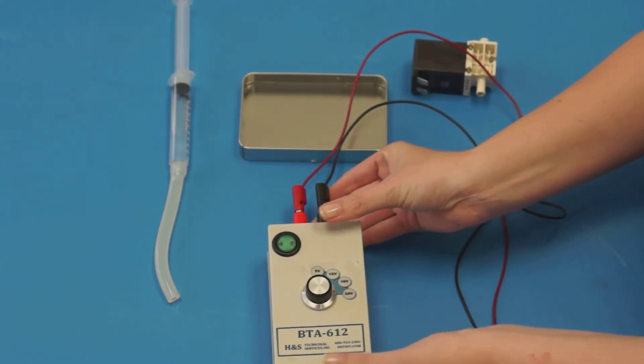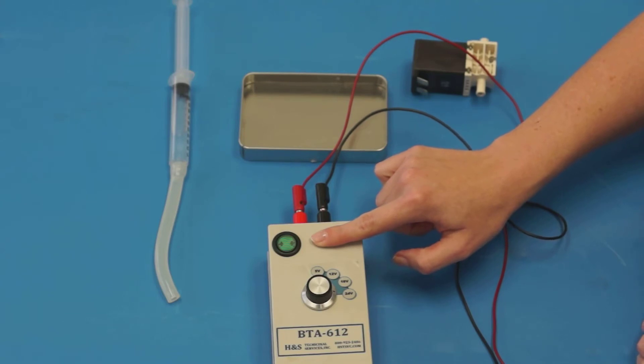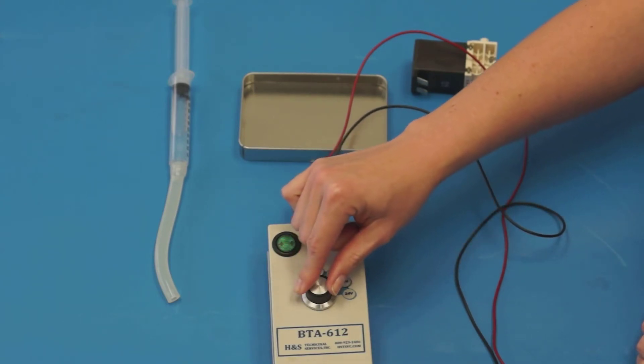To test a valve, ensure the tester is powered off. Set the rotary switch to the 24 volt position.